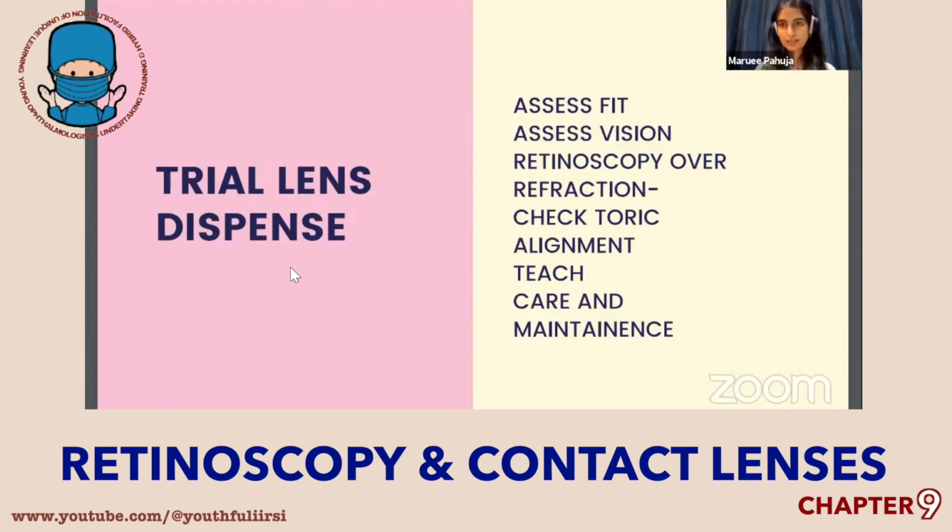And the most important step is the teach: how do you use the lenses when you're back at home without having the support of the practitioner? How do you wear the lenses? How do you remove the lenses? How do you store the lenses? When do you replace your contact lens case? When do you clean your contact lens case? Every single day, the solution in the case needs to be changed.